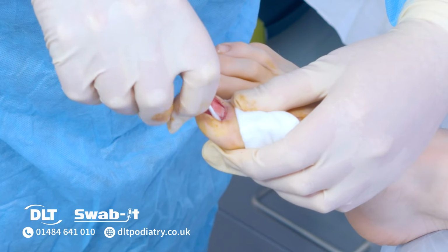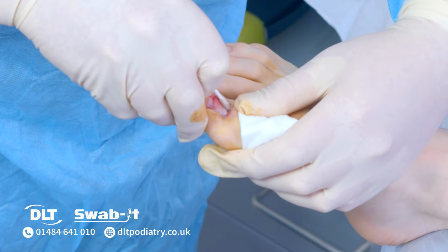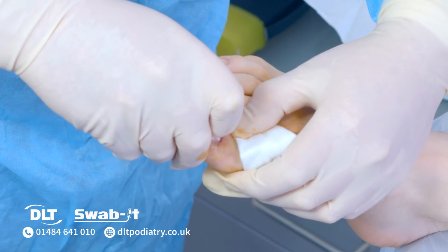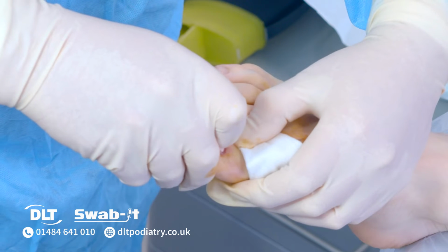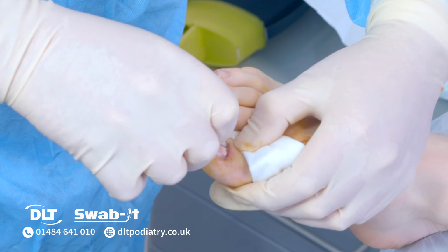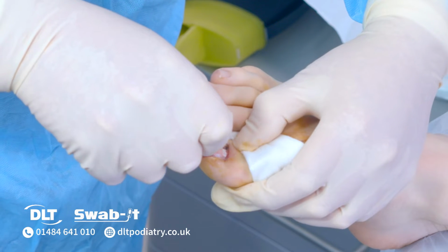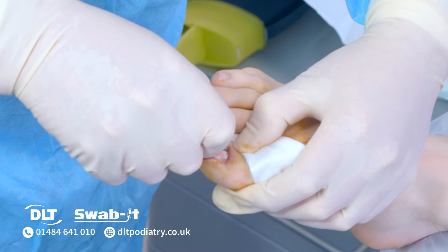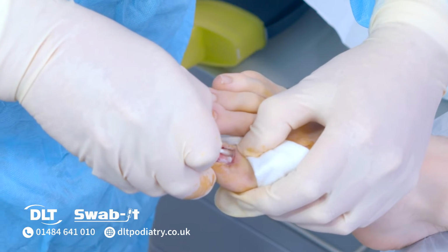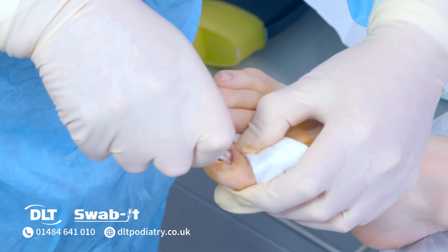Again, you need to just check that all that eponychium has been separated, which it has. If you raise the Swab-It about 45 degrees and then rotate, because the phenol is in this end of the swab, you can see the phenol coming out. Could you start and give me 1 minute? Now I'm ready.